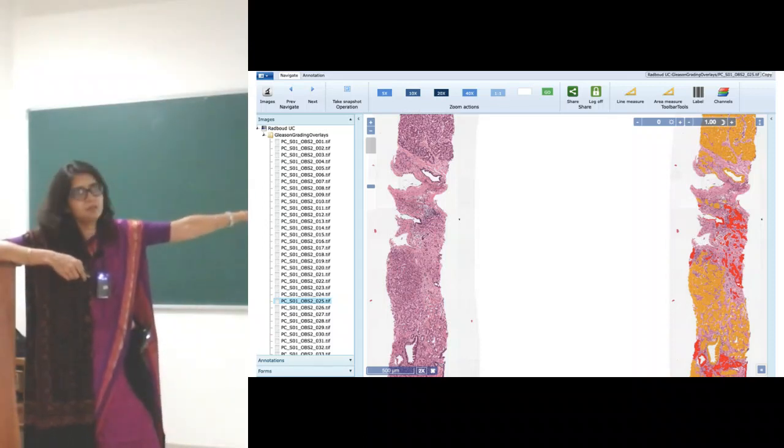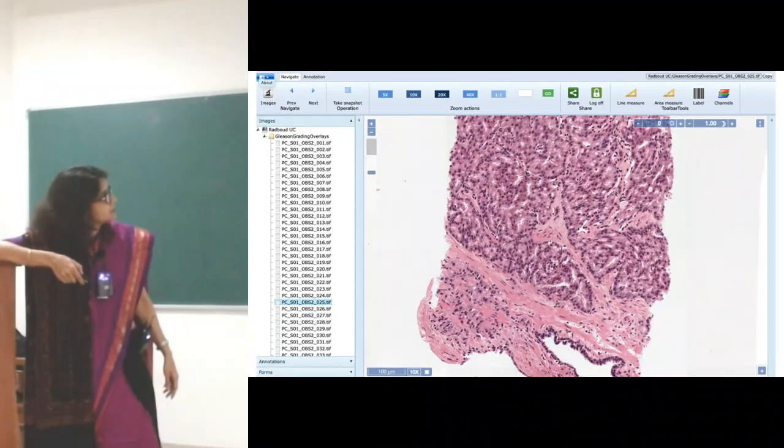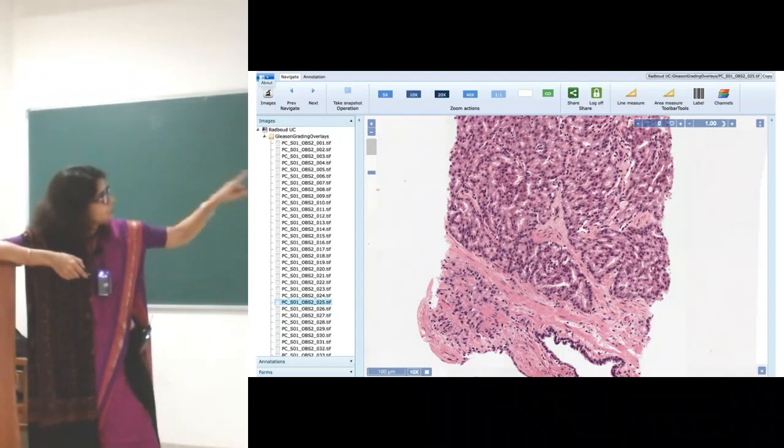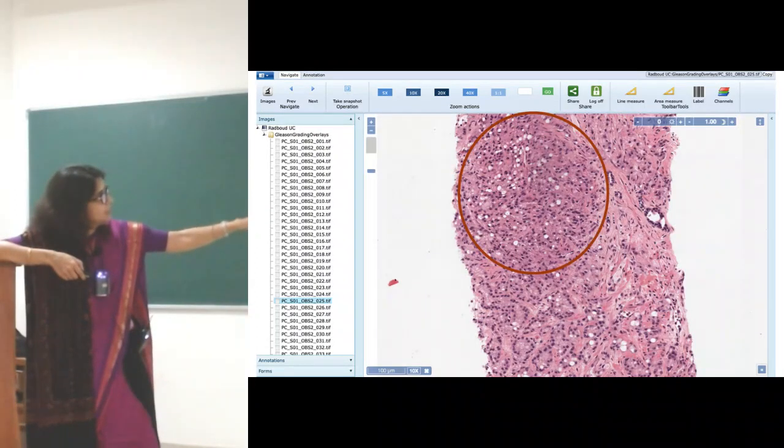This is another biopsy where the red part is pattern 5. In the middle, you'll have to take my word for it. In H&E, there was a little bit of pattern 5, and the remaining top part and bottom part were pattern 4, which the computer AI system identified. This is a pattern 4 H&E tumor, and the computer correctly identified it. This looks very similar to the prior one, but I can tell the circled area is pattern 5 and the remaining part is pattern 4.